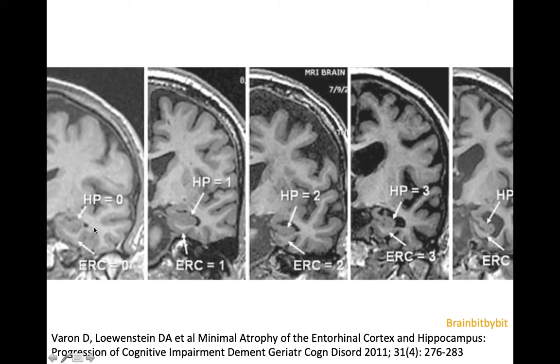You can grade the amount of atrophy with the visual rating scale that is often used, called MTA — mesial temporal lobe atrophy. It is graded from 0 to 4, taking into account the width of the temporal horn, the width of the choroid fissure, and the height of the hippocampus.